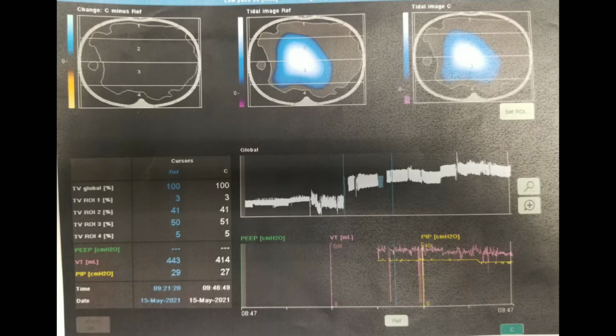So as you can see, we're using this view on the PulmoVista 500 if we are thinking that possibly the patient has a certain amount of inflation, but we might be over distending. It might be time to wean down the pressure. Therefore, this view, end inspiratory trend, is extremely important to give us feedback. Now, if we keep on dropping the pressure and we're still seeing the same amount of end inspiratory inflation, then that's kind of like the equivalent of dropping our pressure control and noticing that either the lung volume improves or remains the same. Therefore, we're getting the same tidal volume with less pressure.